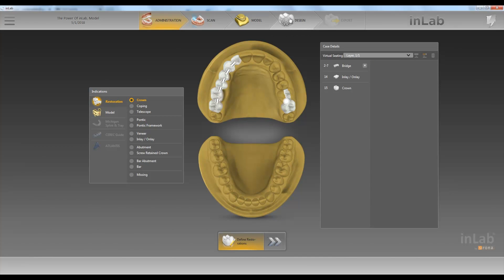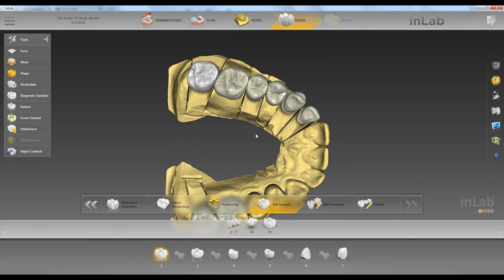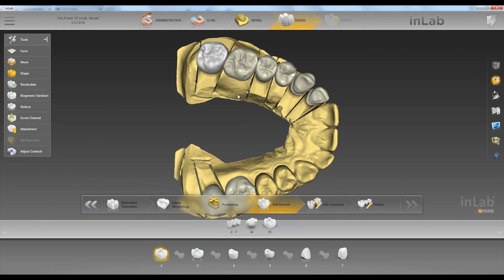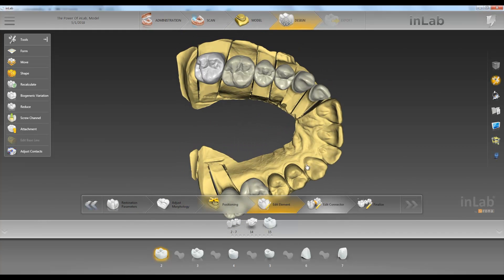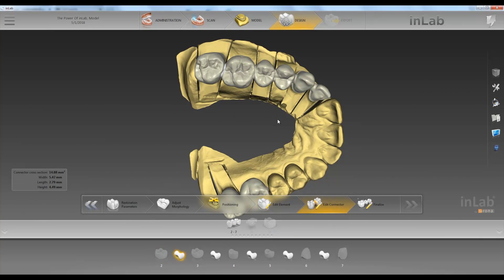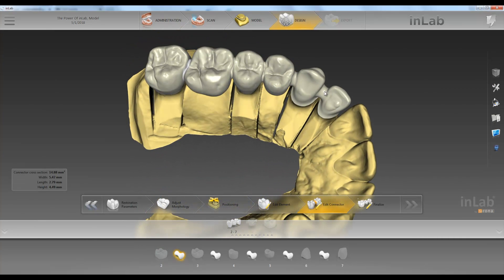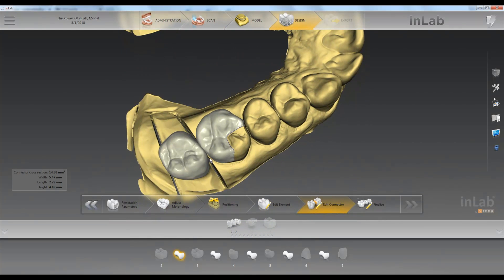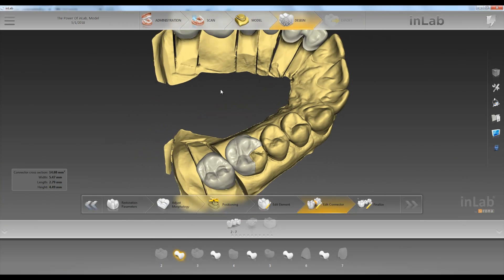We'll go up to the design phase. In the edit element step you can make any adjustments to your bridge that you want. When you click on edit connectors, you'll see our anatomical connectors here, and there is no connector here at all because we chose these as two singles.